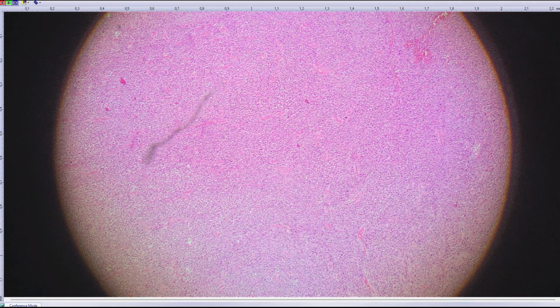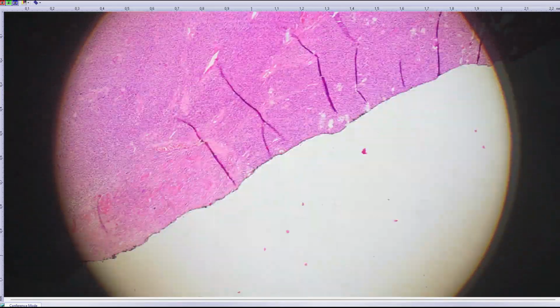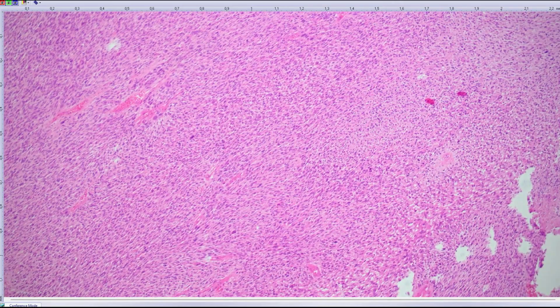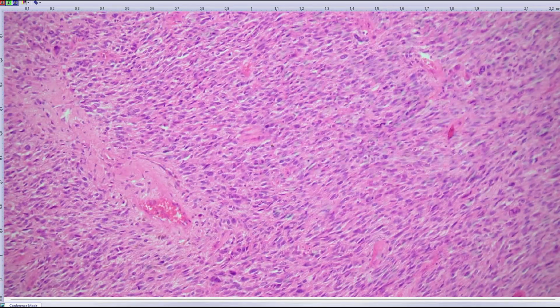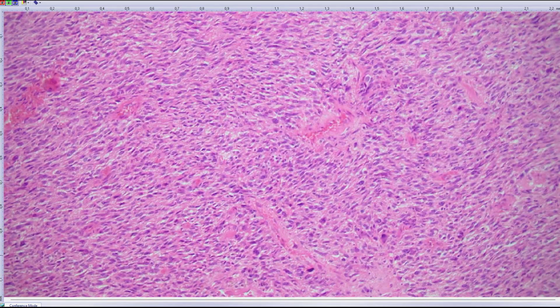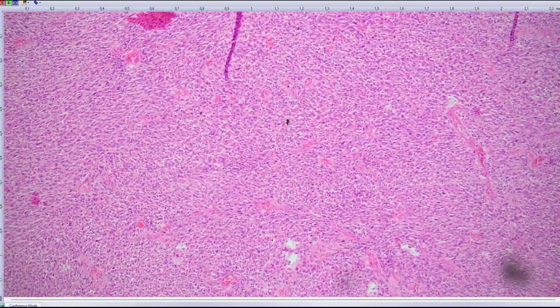Okay, this is a tumor on the back of an 81-year-old male, older guy. Without much looking at it, you can see something quite malignant looking, very cellular. There's a lot of atypia, especially these scattered hyperchromatic large cells. Again, mitotic activity, including atypical mitoses, are there as well.